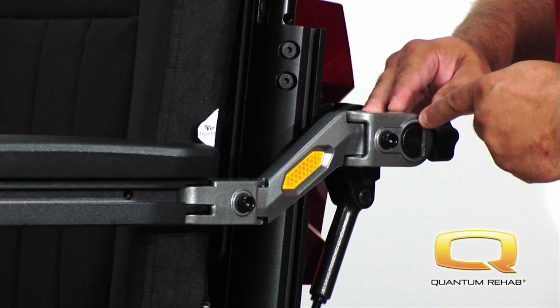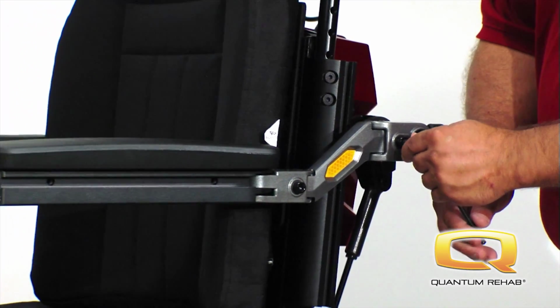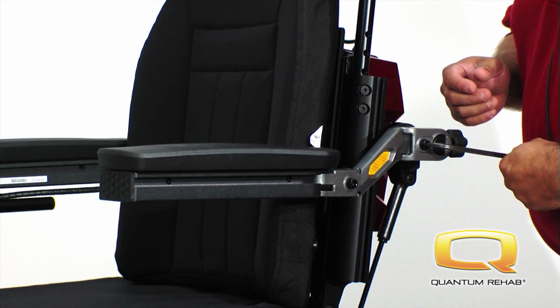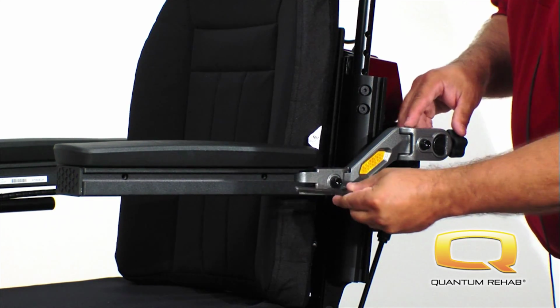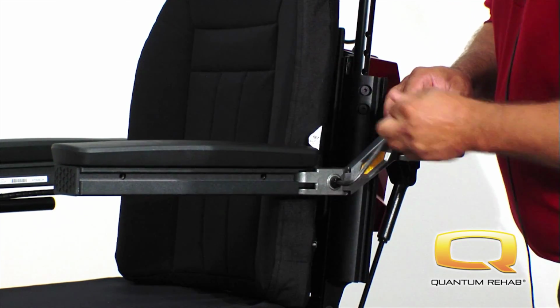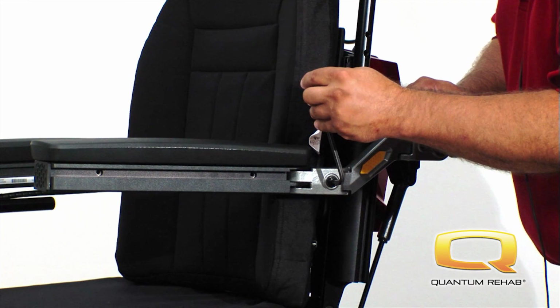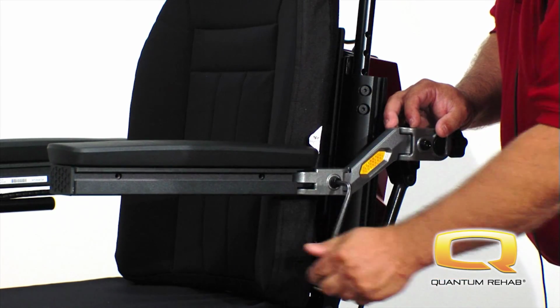To begin, let's start at the outer adjustment point. Right here, you take your 6mm Allen key, and if you would like to adjust the arm out, you turn the arm counterclockwise. Conversely, if you'd like to turn the arm in, you turn it clockwise. Similarly, if I were to move to location 2, which is up at the patient location, if you were to go clockwise, you could turn this in. And this way, the patient that's sitting in the chair could feel more comfortable where the arm is in a more natural position. Again, I'll turn it counterclockwise, bringing the arm out.